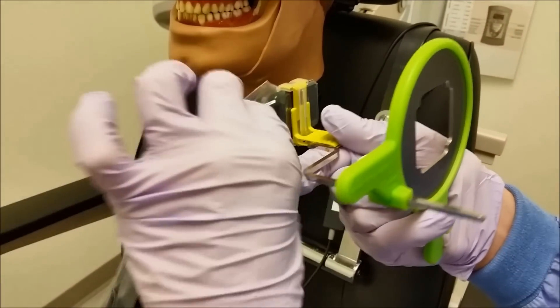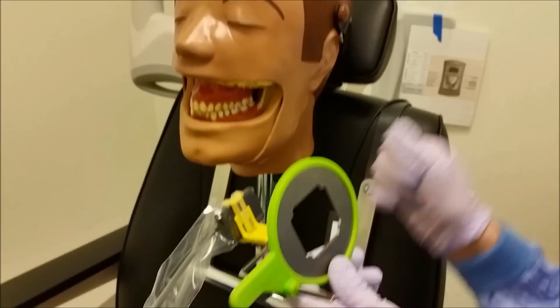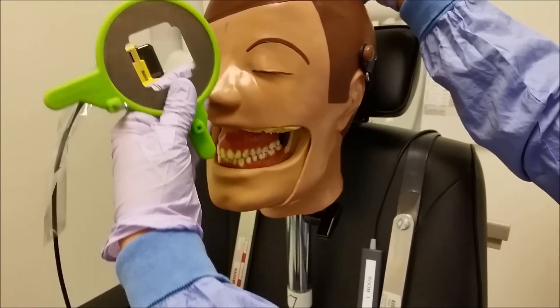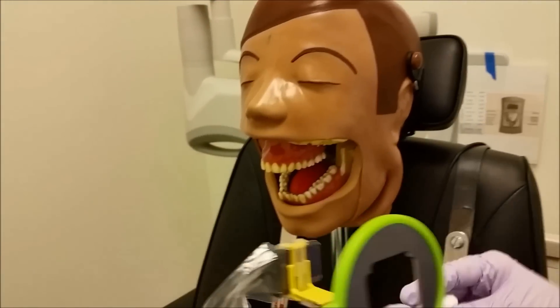This is going to be coming out towards the mouth, out of the mouth, towards the patient's nose. You'll want to open Dexter's mouth as wide as he can go.